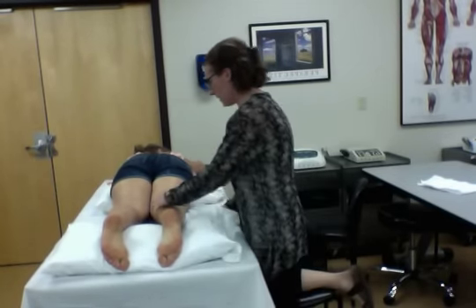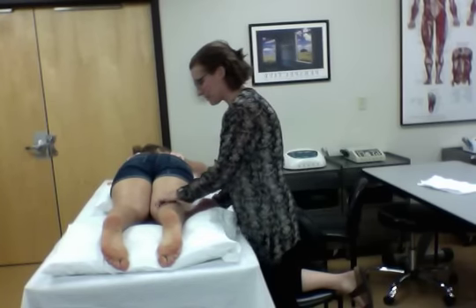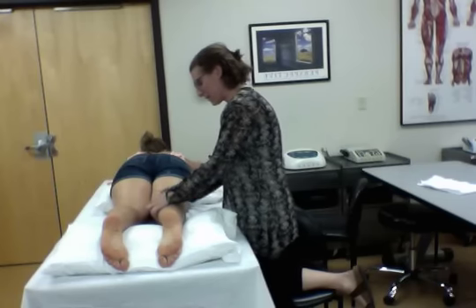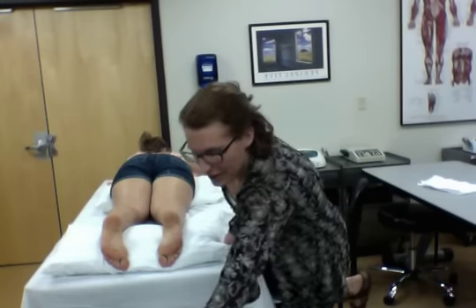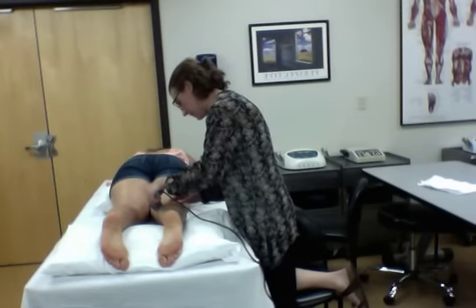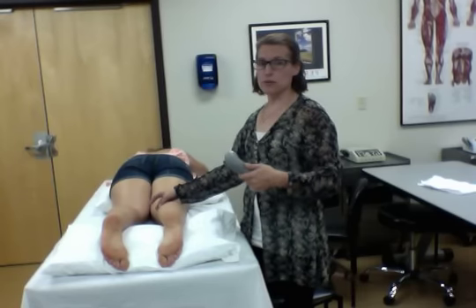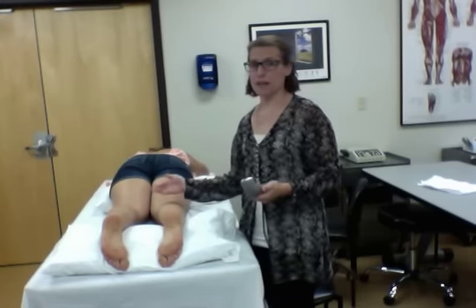And is this about the area where you feel the most pain? Okay, so let's say that I can feel the deformity here, and so I know the spot that I'm going to treat is right here within an area about twice the size of the ultrasound head. If it was bigger than that, then I would do 2 separate treatments. That goes for the thermal ultrasound application as well.